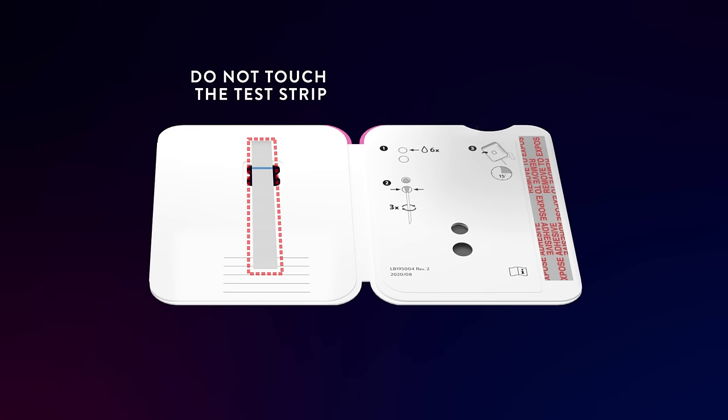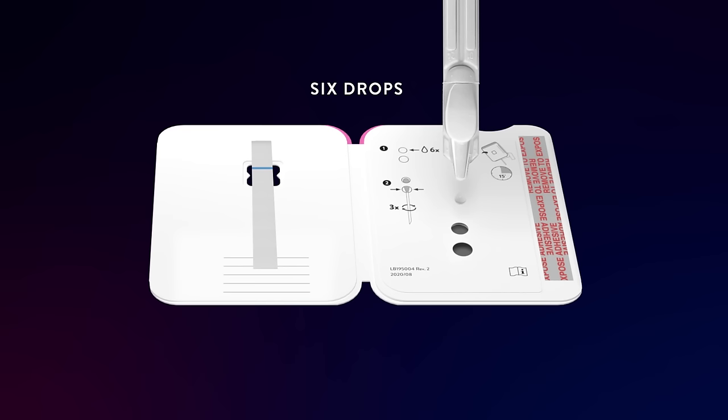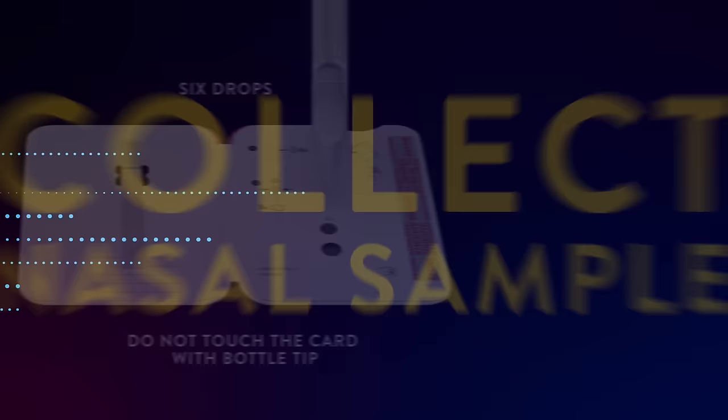Remove the dropper bottle cap. Hold the dropper bottle straight over the top hole, not on an angle. Slowly put six drops into the top hole. Do not touch the card with the bottle tip.